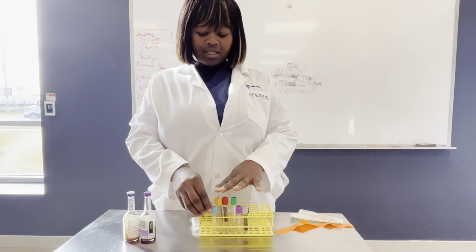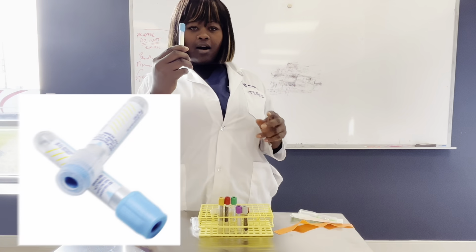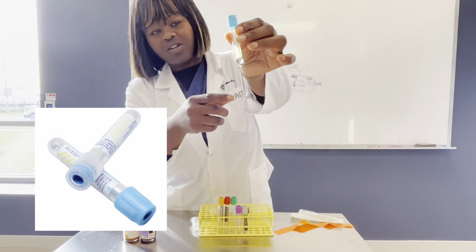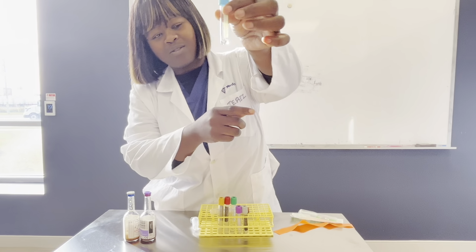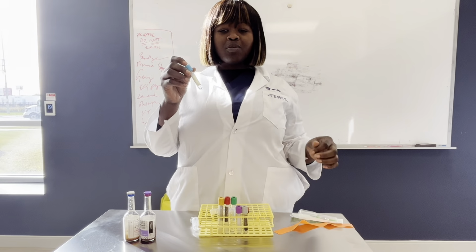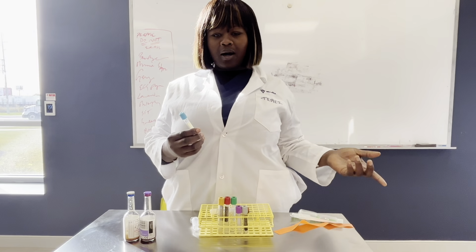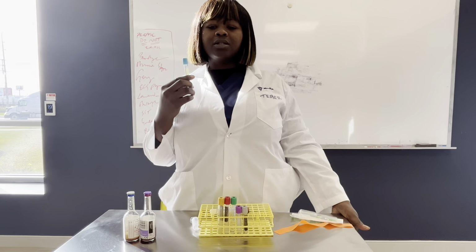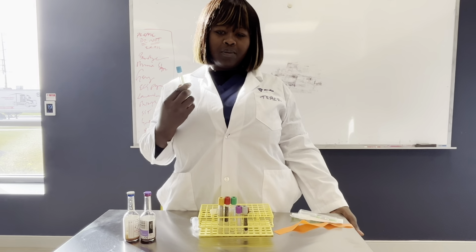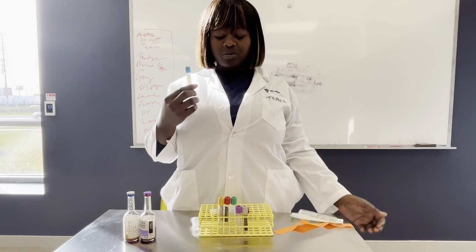So the next tube in the order of draw are the light blue tubes. These tubes include sodium citrate. You can see that at the bottom. So this is an additive. Sodium citrate stops the blood from clotting too soon. It keeps the blood liquid for tests checking how it clots. It works by grabbing onto calcium, which is important for clotting, and prevents it from doing its job. This way, tests for clotting can be accurate and not mixed up by clots forming too early.